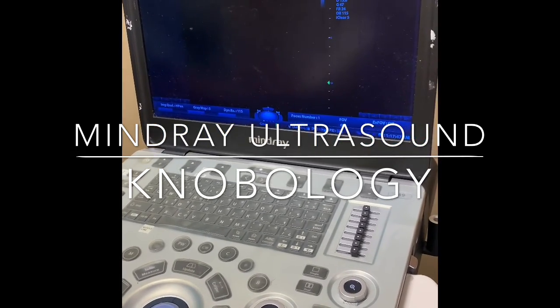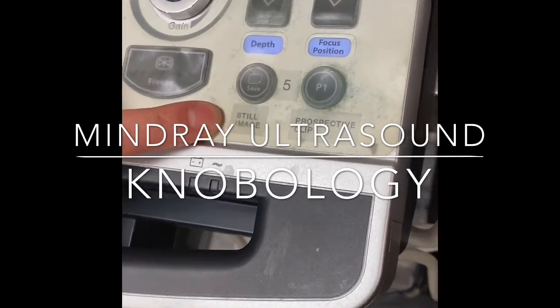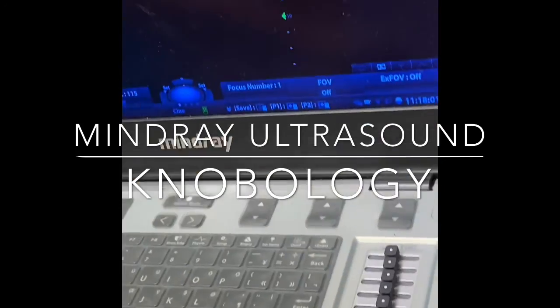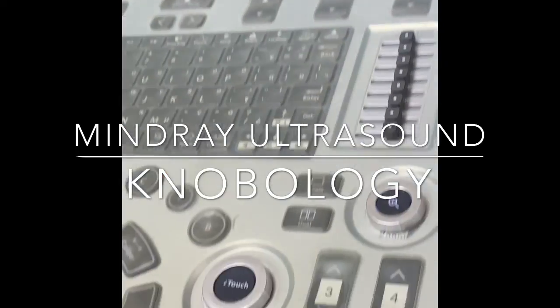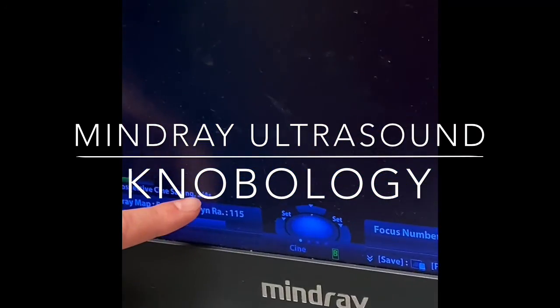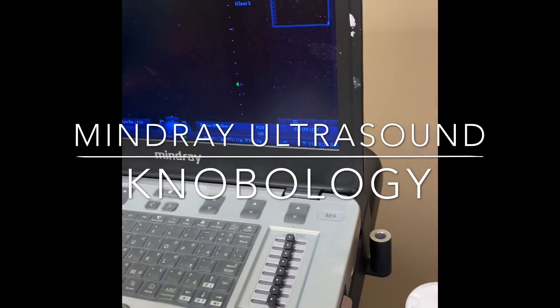When you're ready to save an image or a clip, we have these 2 buttons right here. This one is labeled still image. If you press still image, it saves one image that you're looking at. And you could see that a thumbnail populated up here. If you want to save a clip, you press prospective clip. And you can see that it's telling you it's saving 1 of 4, 2 of 4, 3 of 4 seconds, and so forth. When it's saved, the clip populates right here.